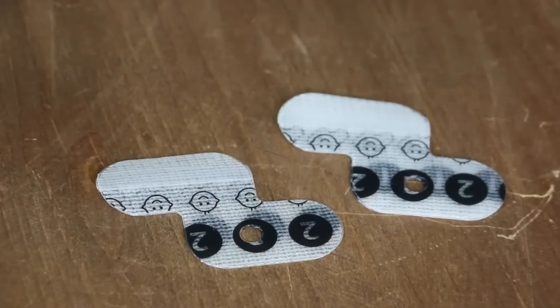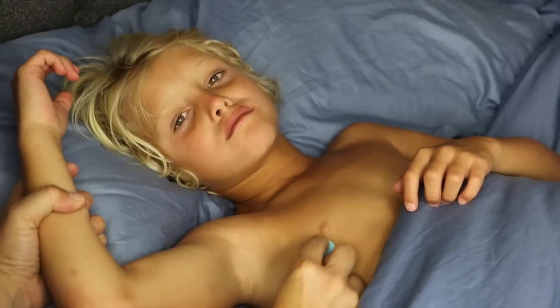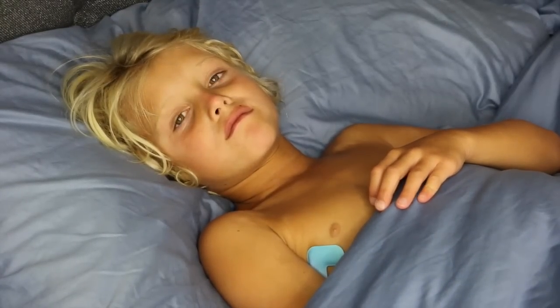Here's how it works: you have the temperature sensor and there are adhesive sticky pieces that come with it — they look like this. It comes with eight of them, and each one works for pretty much one use, about 24 hours. You take it off, throw it away, and put a new one on the next time your child is sick. You place it directly on their skin right underneath their arm, have them put their arm down, and then it wirelessly talks to the app on your cell phone.